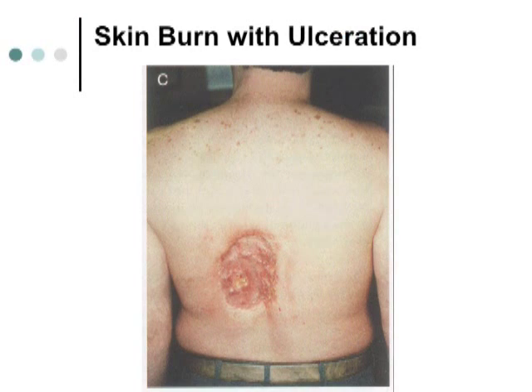Now, nobody would like to see this in their patients, but this is actually a patient that was burned by a C-arm. Okay? It's estimated he got about 2,000 rads of radiation over a 5-hour period. Now, C-arms, notice the habitus of this patient. Would you consider him hypersthenic, sthenic, or asthenic?